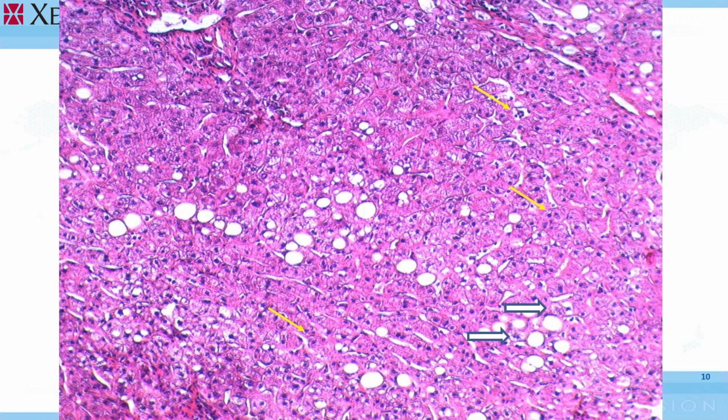Their cytoplasm is degraded, staining lighter than in live or normal cells, and sometimes is described as a wispy cytoplasm. Nucleus in the ballooning hepatocytes is necrotic, undergoes disintegration, and is located in the center of the cell, rather than pushed by the vacuole of fat to the side of the cell. Inflammatory cells implicated in this form of necrosis are often seen in the immediate vicinity of balloon hepatocytes.